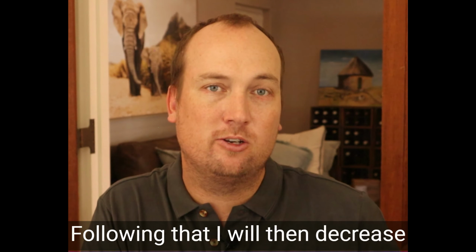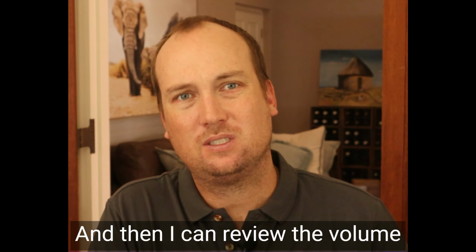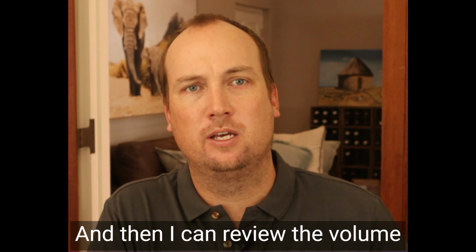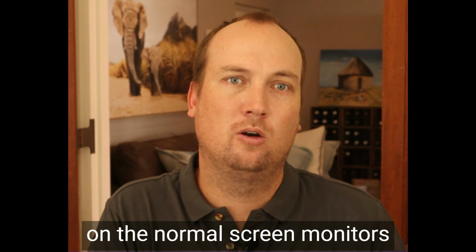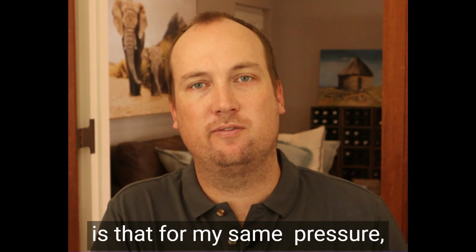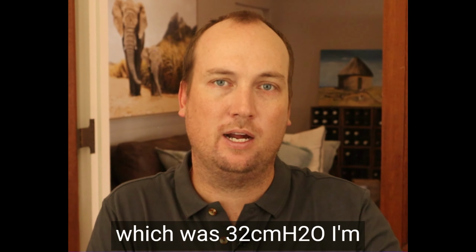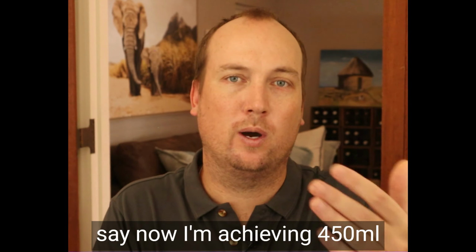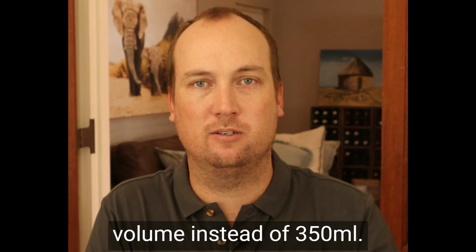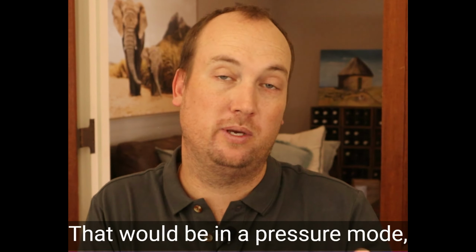Following that, I will then decrease the tidal volume again to 6 mils per kilogram. And then I can review the volume pressure ratio that I've attained on the normal screen monitors or on the compliance curve. And what I'm hoping to see now is that for my same pressure, which was 32 centimeters of water, I'm achieving a higher volume. Say now I'm achieving 450 mils volume instead of 350 mils. So that tells me that the compliance has improved. That would be in a pressure mode.